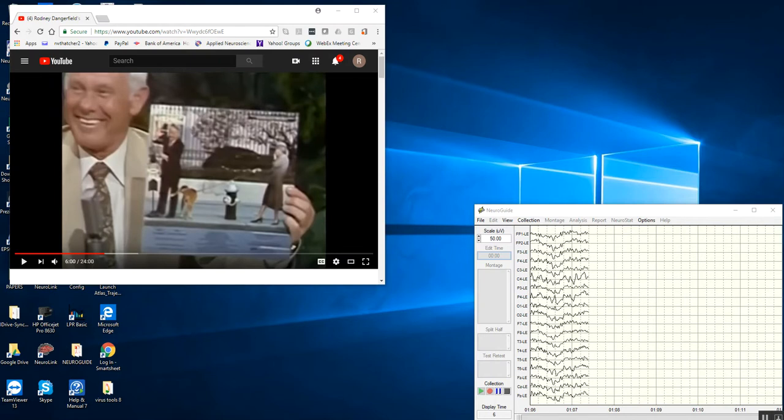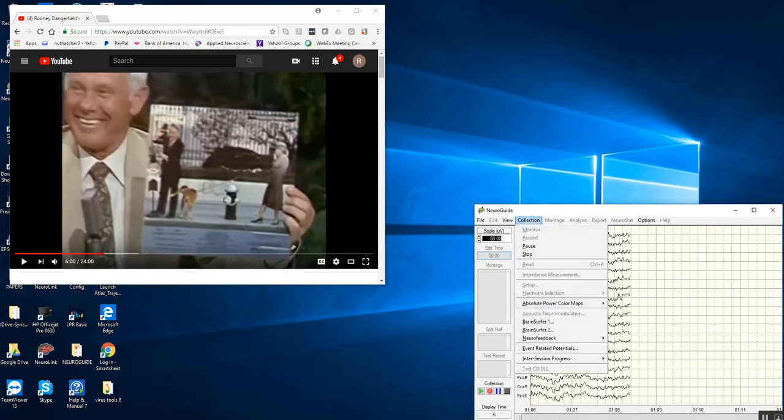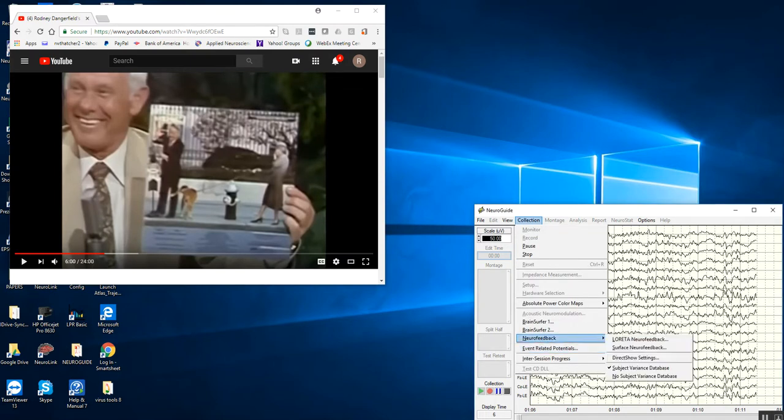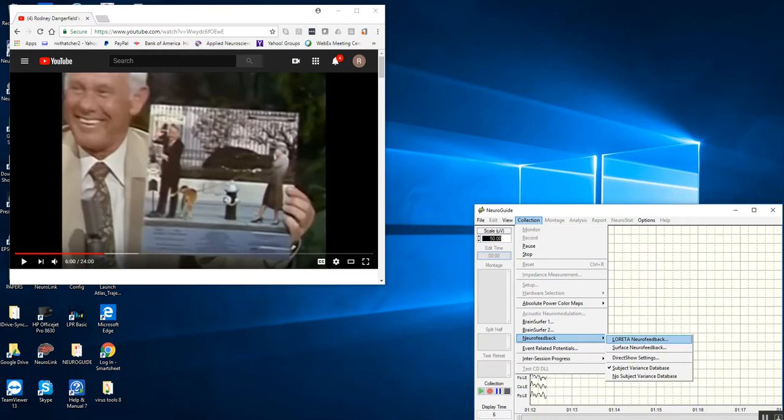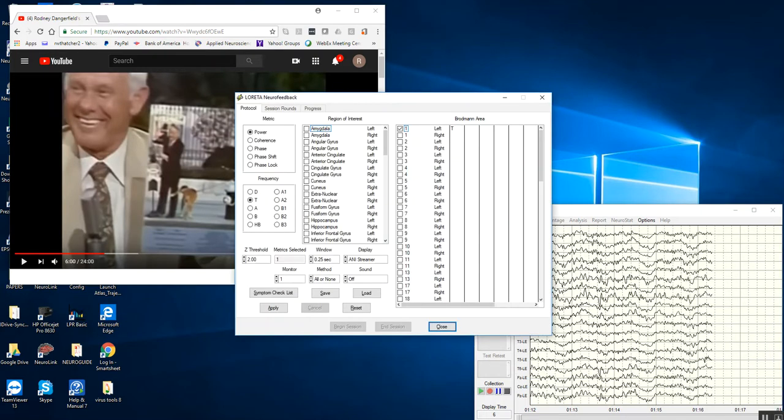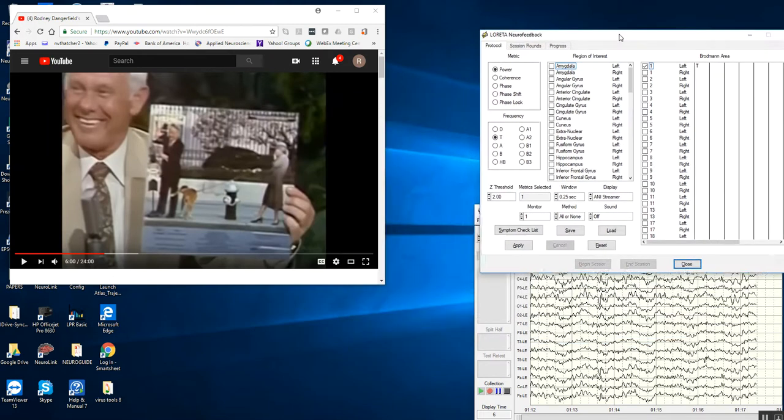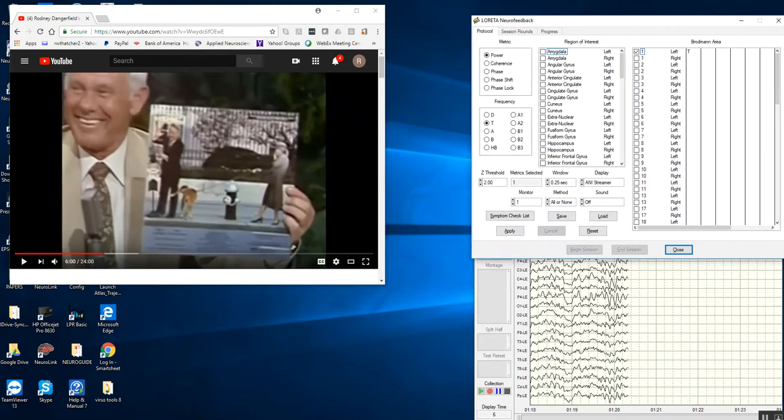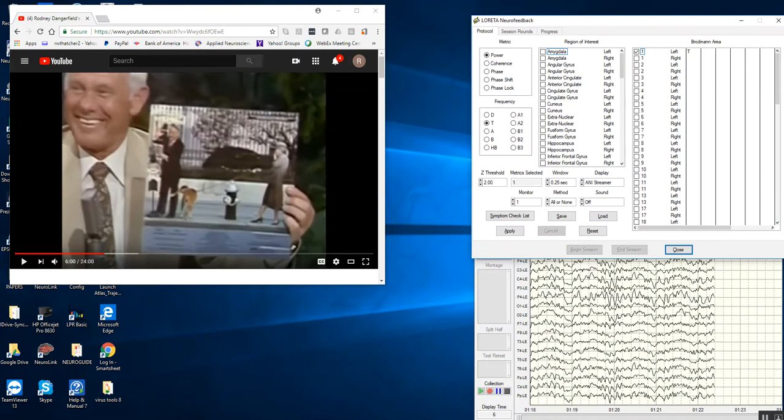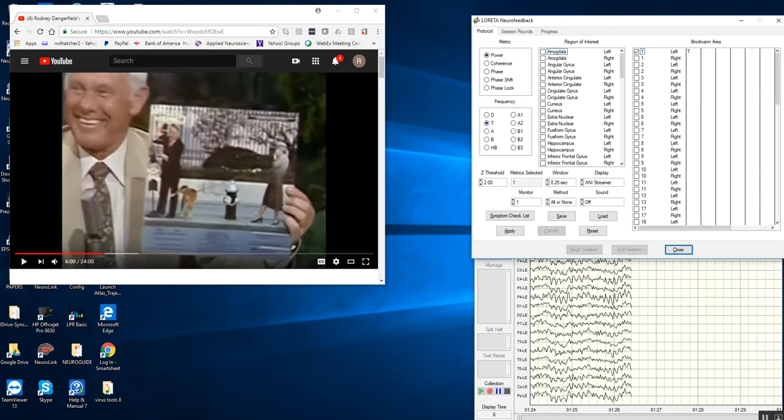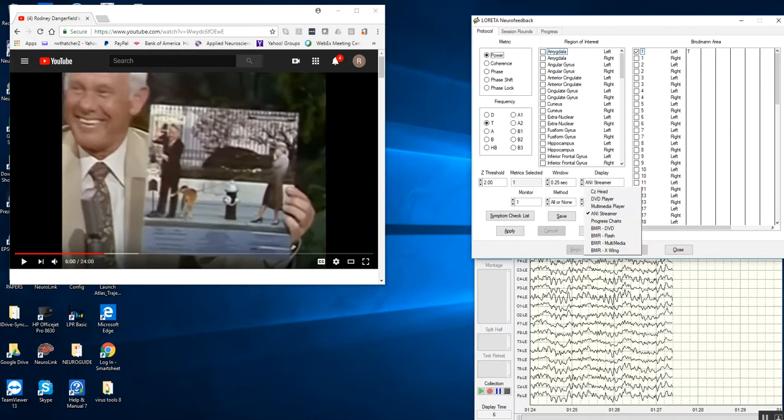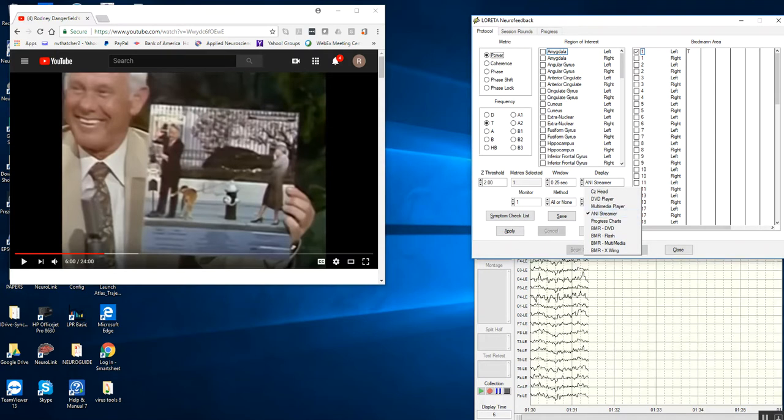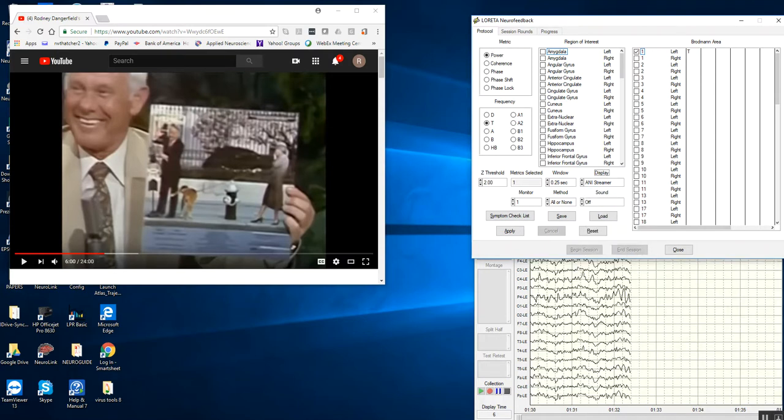This is a demonstration. I'm going to click Collection and then Neurofeedback. I'll go ahead and look at Loretta Neurofeedback. I'm going to move this up here so it's out of the way. I've just selected broadband area 1 for power or current density and theta. I've selected the ANI Streamer in the display list, as you can see here. That's the one that you want to select.